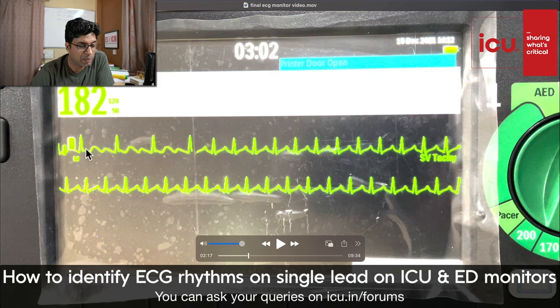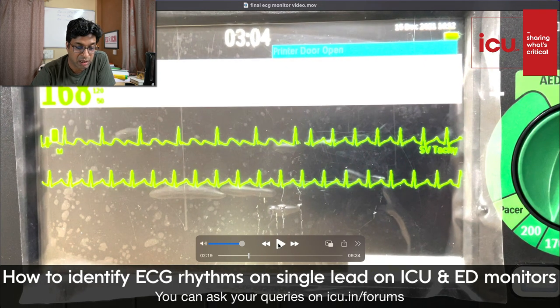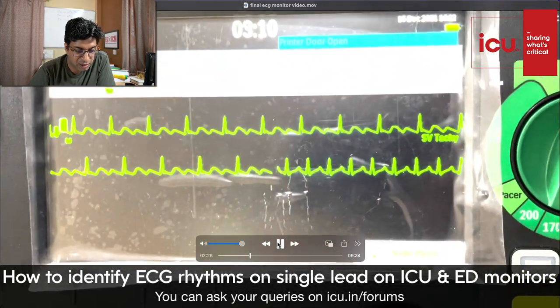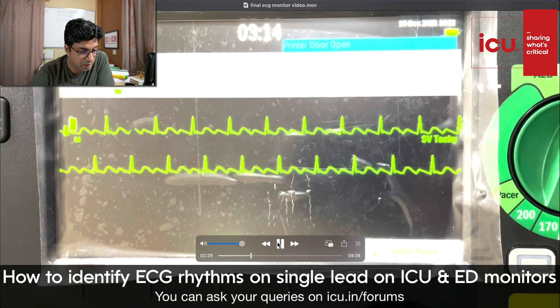Now everybody can appreciate this is a sawtooth pattern. So it is atrial flutter. This is definitely flutter. Atrial, again, not sinus flutter. It's atrial flutter because it is not originating from the sinus node, the SA node, but from another place in the atria. So it's atrial flutter, still atrial flutter. I'm again sorry for this shaky video because I recorded from a handheld mobile.